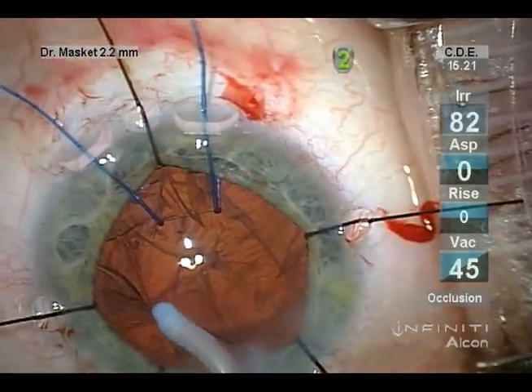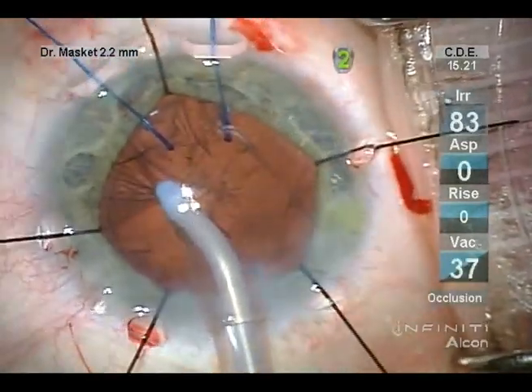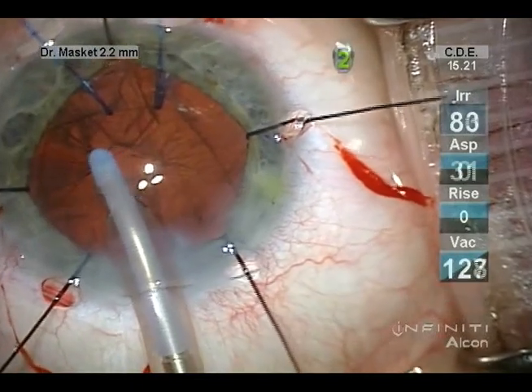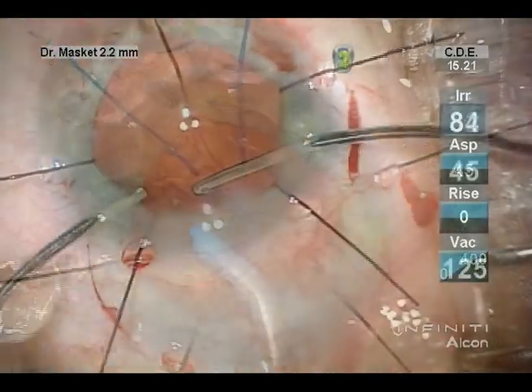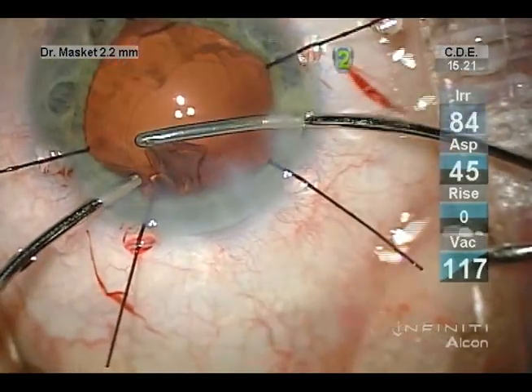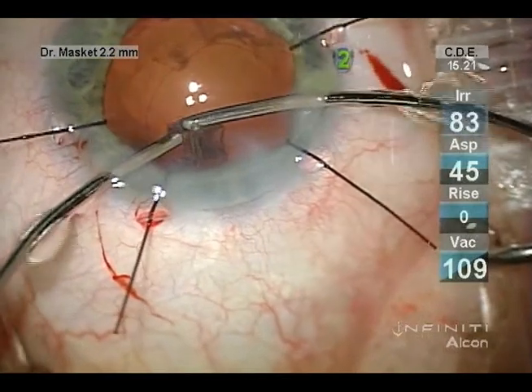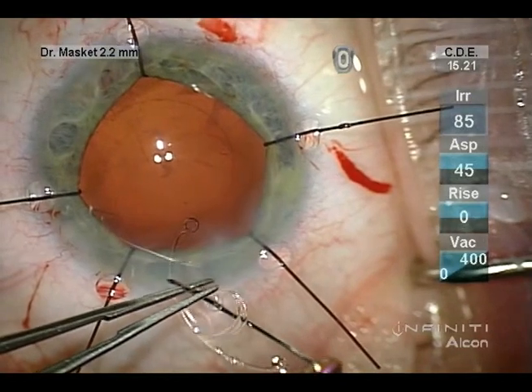Notice the difficulty in removing the cortex as a result of placing the capsule tension ring early in the surgery. A Henderson-style ring might have facilitated it, as well as emptying the bag before placing a CTR. However, because of the malpositioned cataract, I felt it was necessary to place the CTR earlier. Manual cortical removal is somewhat more efficient in this situation.